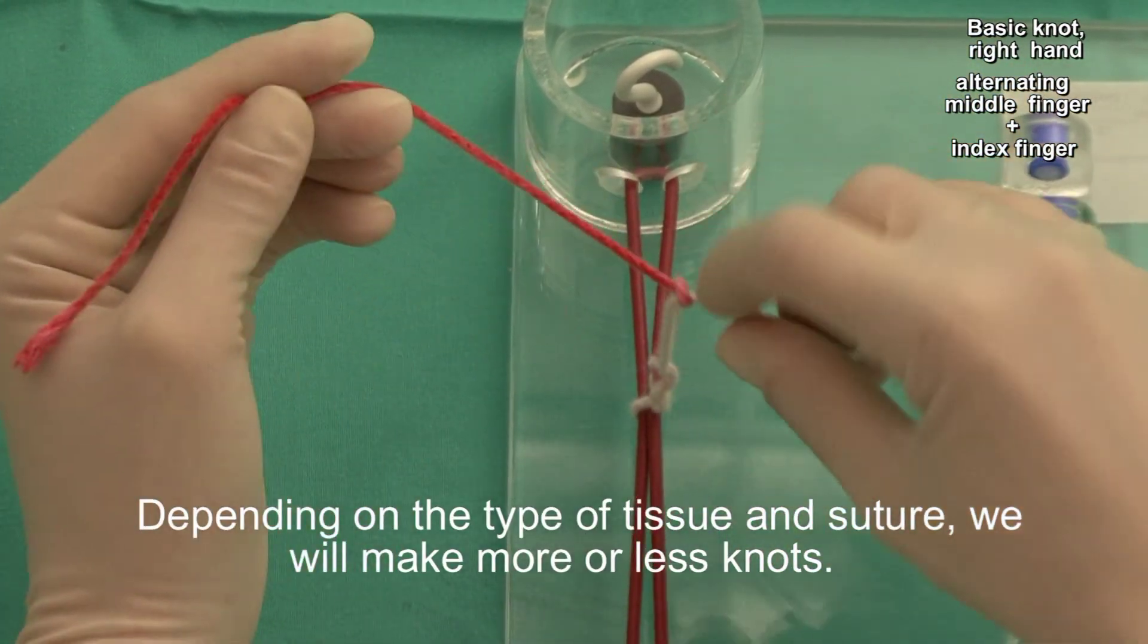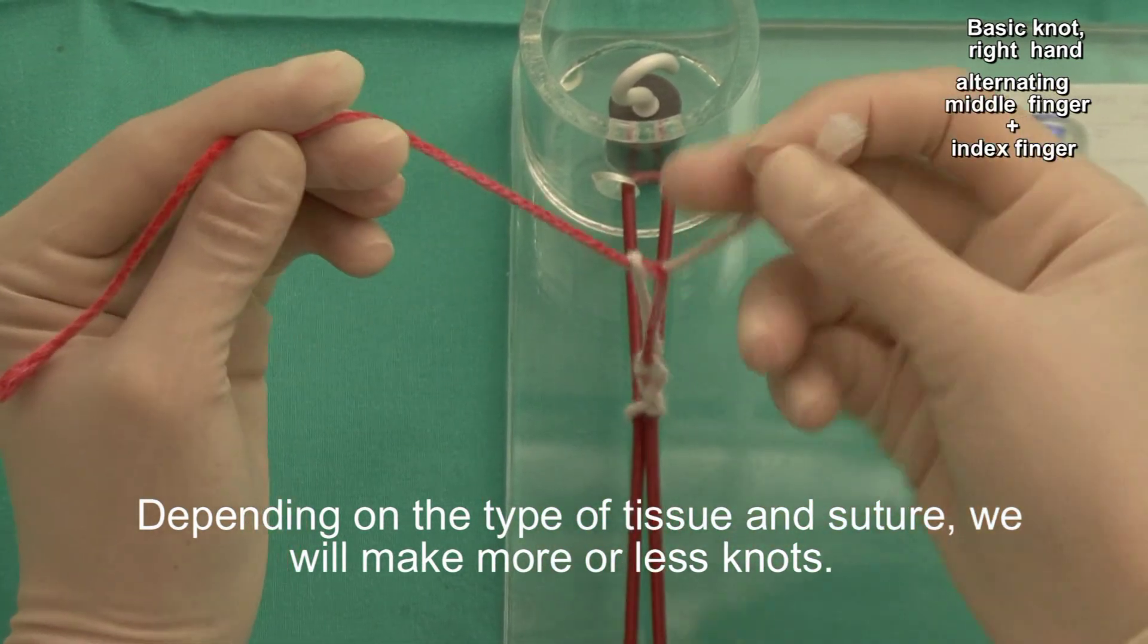Depending on the type of tissue and suture, we will make more or less knots.